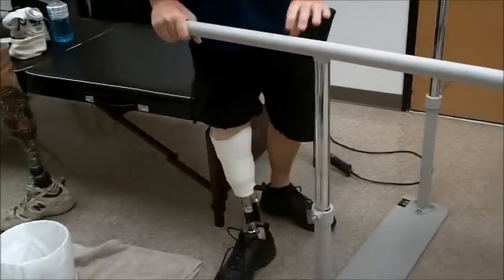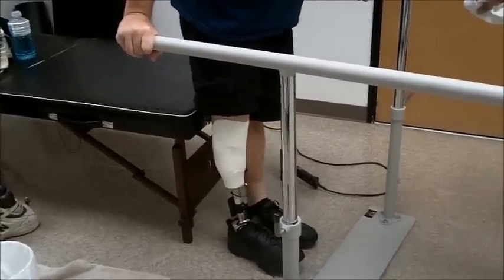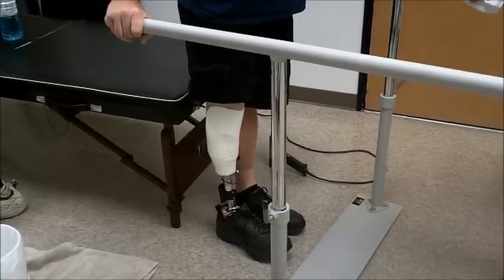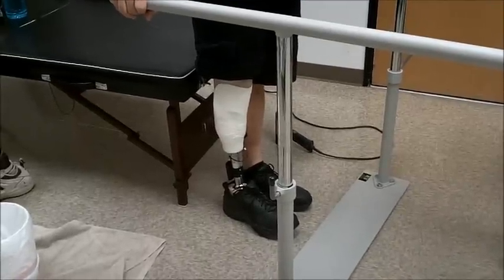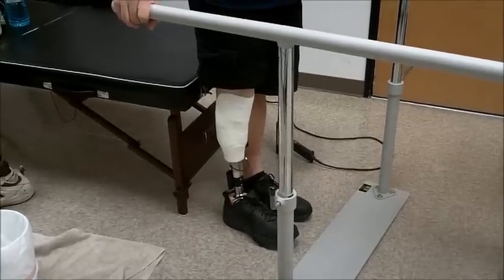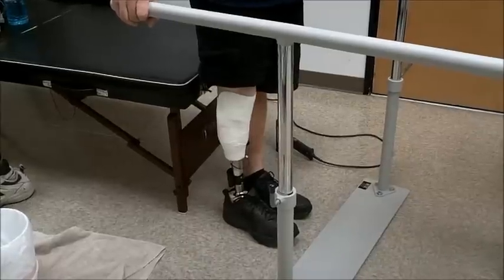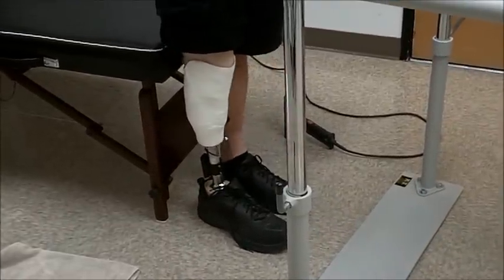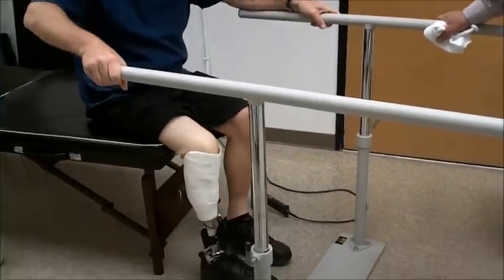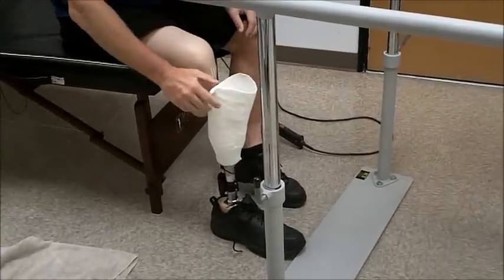Even with an incredibly inset foot — remember, we didn't bench-align, we didn't do anything we should have, we just slapped this together — we're okay. The MagLock is working fine. There's always something to do, and this is a test socket — this is where you learn and test things. The idea here is that in your cast you're taking an extra step and getting one more thing out of it. Go ahead and sit down, push the button, and it slides right out. Very easy.